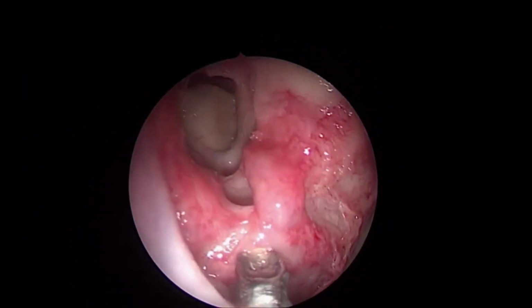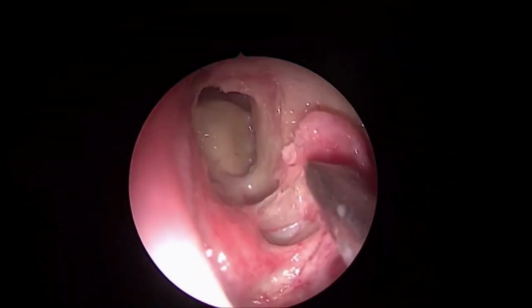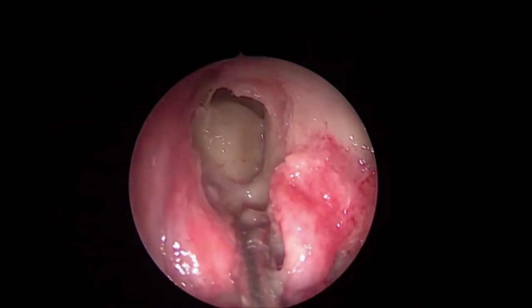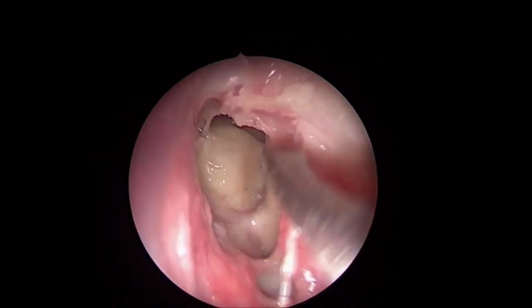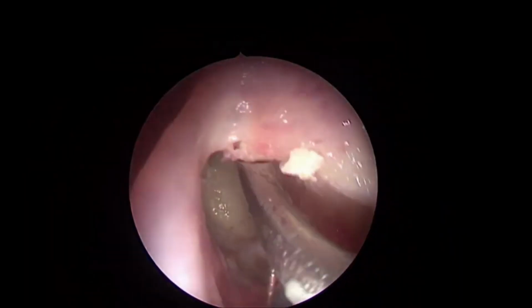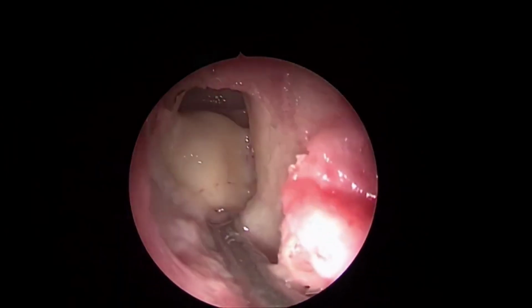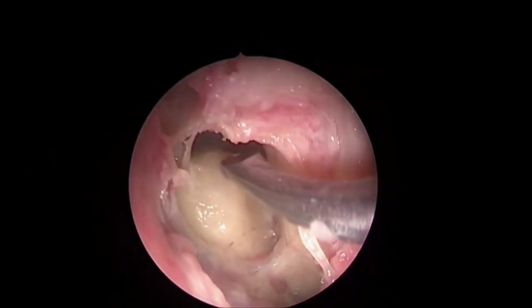So this was about the bulla, which was very rudimentary in this case. See this, only a small one. It was not going up to the skull base. It was not covering the anterior ethmoidal artery. Now, another advantage of the 70 degree. When we use the 70 degree directed anteriorly, to the beak, see this? Our direction with the 70 degree and instrumentation are towards the beak. We are always away from the territory of the anterior ethmoidal artery, so we are automatically directed away from damaging it.